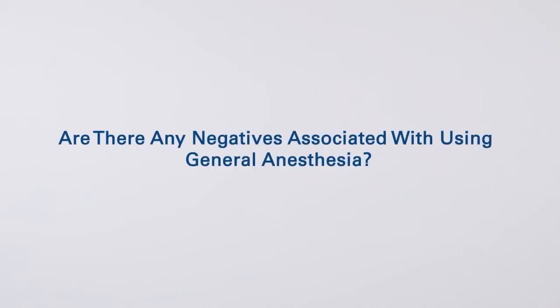So the question always arises, is general anesthesia mandatory for S-ICD implantation? We looked at our data at Ohio State. There are very few reports in the literature. We have 2 or 3 of those reports. We saw that general anesthesia in these high-risk patients who had low ejection fractions, idiopathic cardiomyopathy, and dilated cardiomyopathy, along with being on multiple myocardial depressant drugs, and our anesthetics also depress the myocardium and cause peripheral vasodilation.